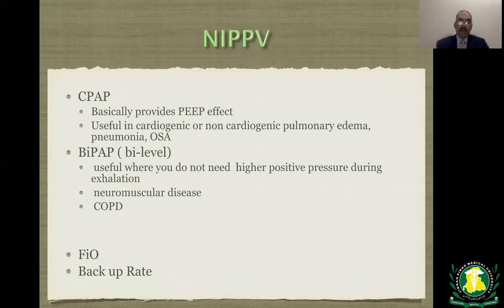CPAP stands for continuous positive airway pressure. So if you put a patient on a CPAP of 10, that means there will be 10 cm H2O pressure both during inspiration as well as during expiration. It is useful in conditions such as cardiogenic or non-cardiogenic pulmonary edema, pneumonia, sleep apnea, etc.